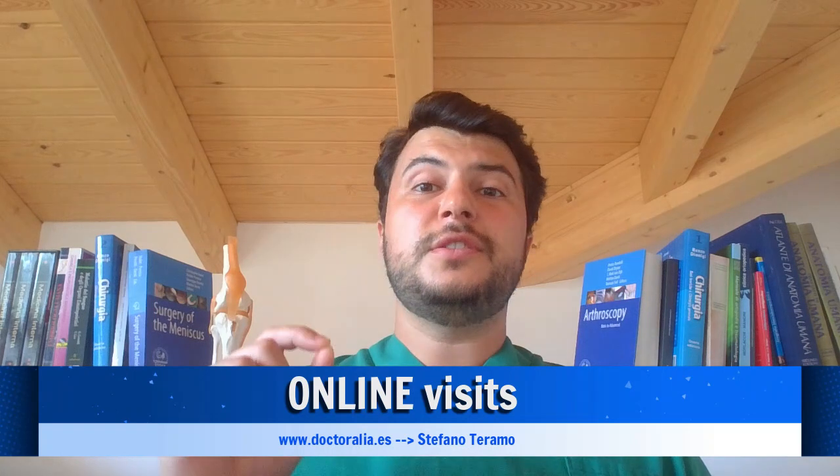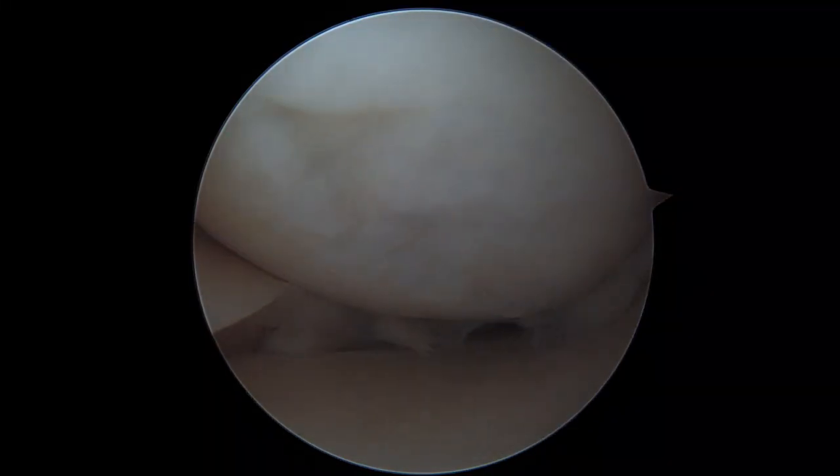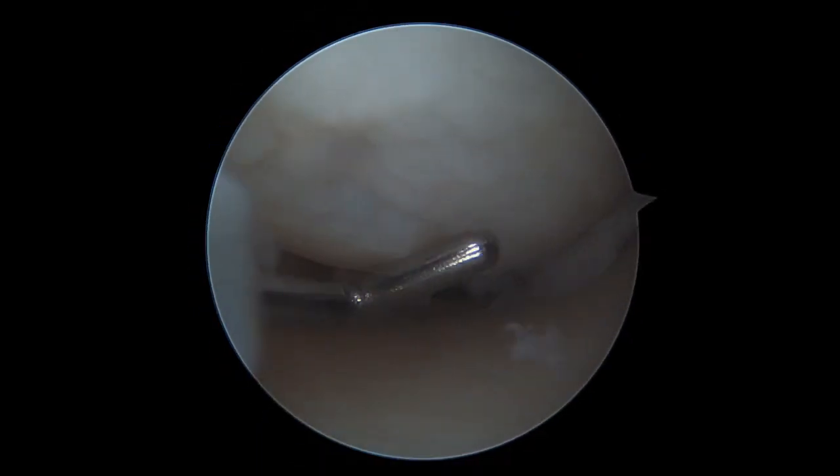We just saw the example of a traumatic tear of the posterior horn of the lateral meniscus. Now let's turn our attention to another kind of lesion. This is the degenerative flap lesion on the posterior aspect of the medial meniscus. In fact, we insert our arthroscope and we assess the quite degenerative aspect of the medial compartment with a mild chondropathy at the medial femoral condyle. In this case, we have grade 2, 3 of chondropathy.